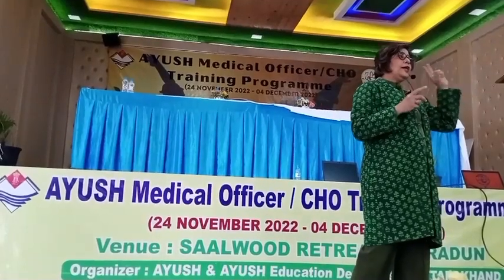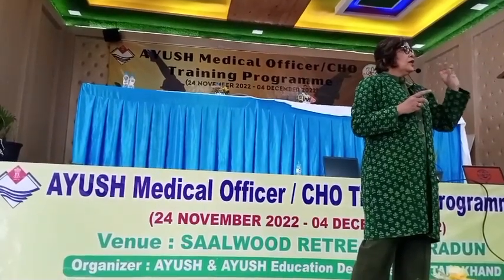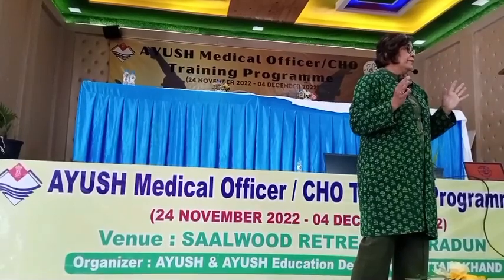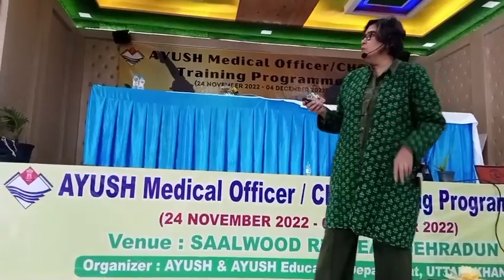There should be two identifiers on that tube. It can be your mobile number, it can be your age. It can be these two. Mainly we take this as per NABL. We take these two identifiers so that there are very rare chances कि एक ही patient के दो नाम, age, phone number एक ही हो. So what happens is we confirm the patient's identity.